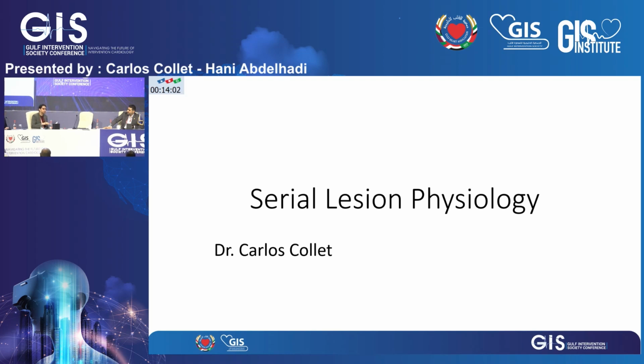On that note, we always have to remember that ischemia is a continuum. While we like numbers, 0.79 versus 0.81 are not different enough. We need to make the decision on the treatment strategy based on that continuum. So we know that a patient with an FFR of 0.65 is much more likely to be impacted by treatment than a patient with an FFR of 0.79. And so all of these things have to be taken into account.